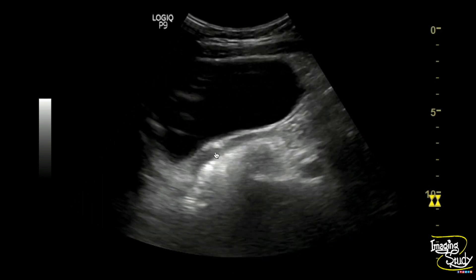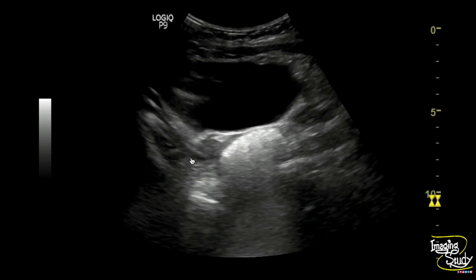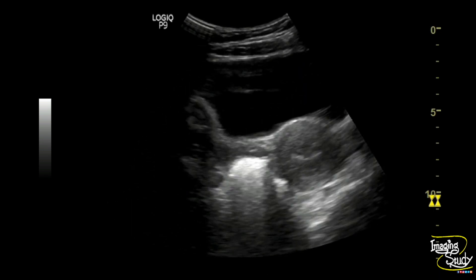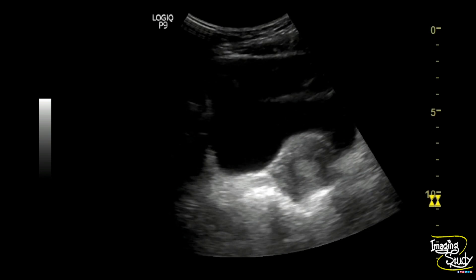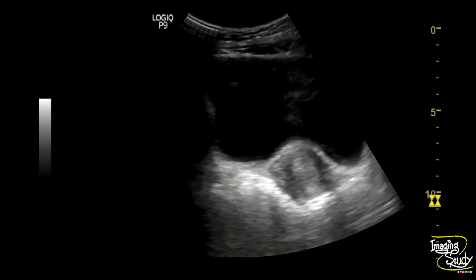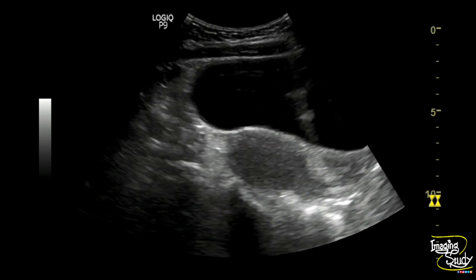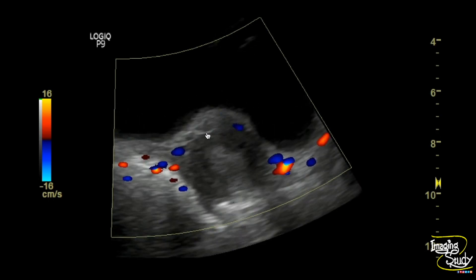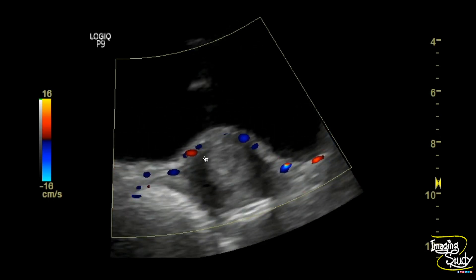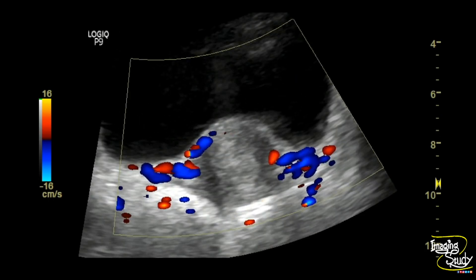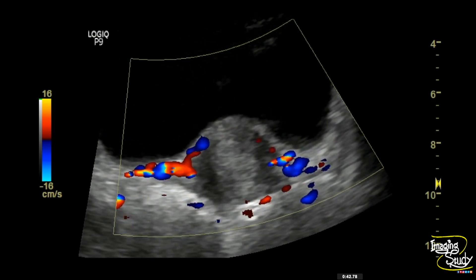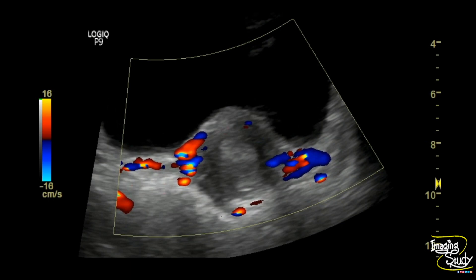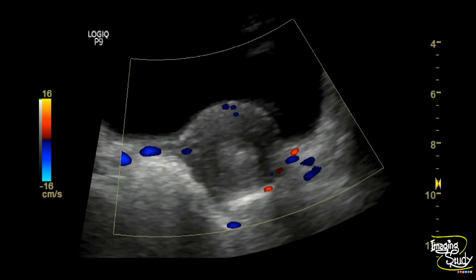You can see the right ovary here. On color Doppler you can see the peripheral vessels and there is no aggressive vasculature supplying this complex area. This feature suggests it as a case of incomplete abortion or retained products of conception.